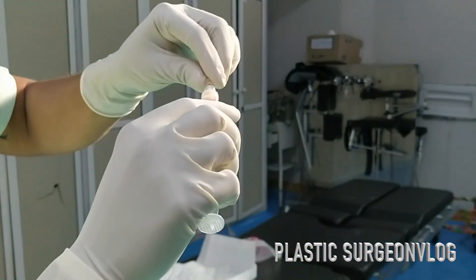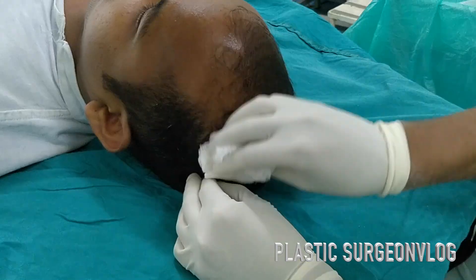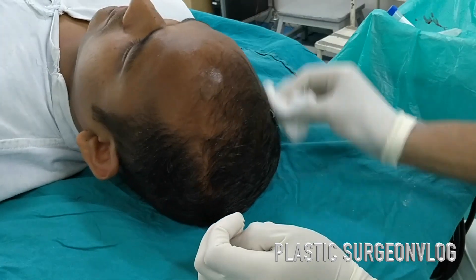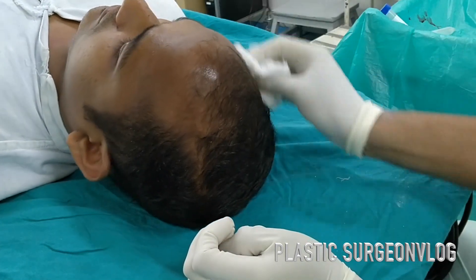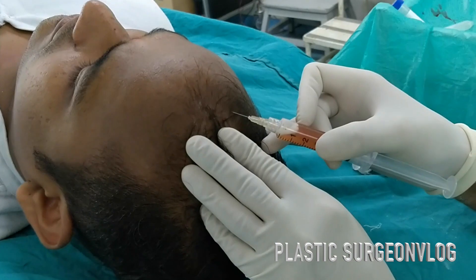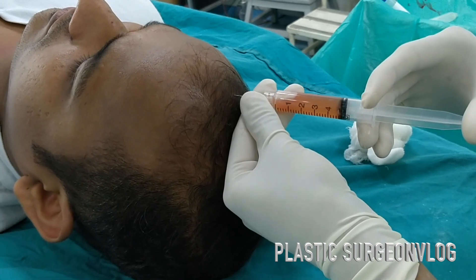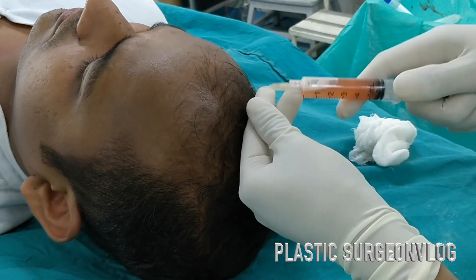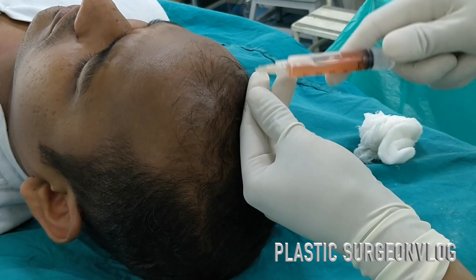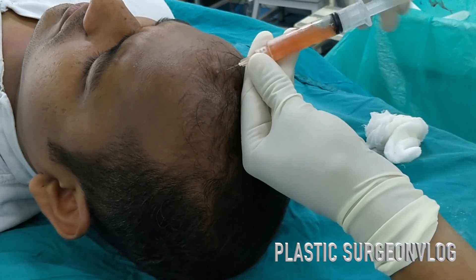This is the final solution of the PRP. I am cleaning the patient's scalp before the injection of the PRP solution, which is the final solution for the hair follicle roots, applied to the scalp of the patient.